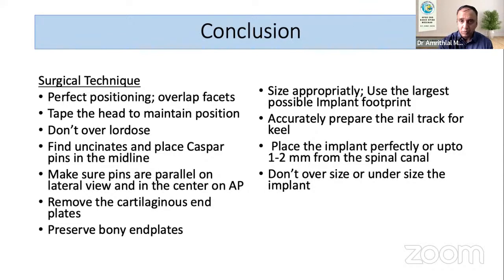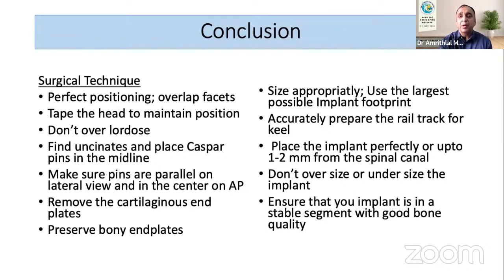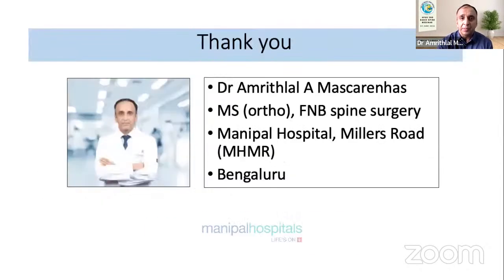Don't oversize or undersize the height of the implant. If you oversize it, then the pressure on the facet joints above will increase. If you undersize, then it may not fit well. It may be a loose implant. And ensure that your implants are put in a stable segment with good bone quality.